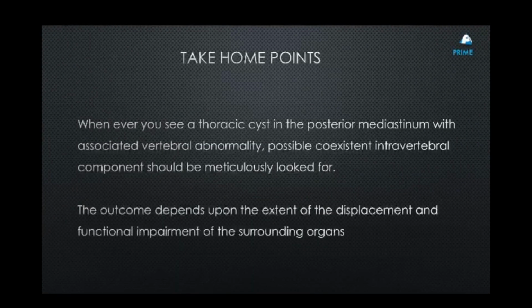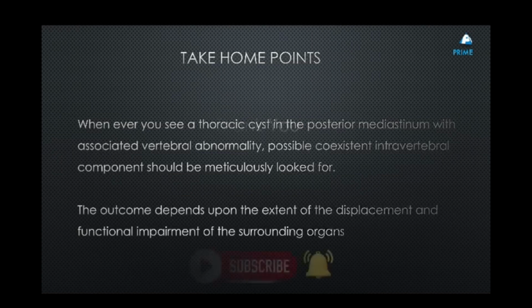So the take-home points from this particular case is that whenever we see a thoracic cyst in a posterior mediastinum with associated vertebral anomaly, possible coexistent intravertebral component should be meticulously looked for. The outcome depends upon the extent of the displacement and functional impairment of the surrounding organs.